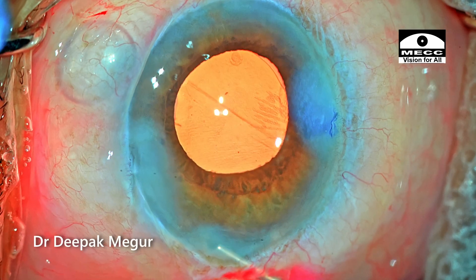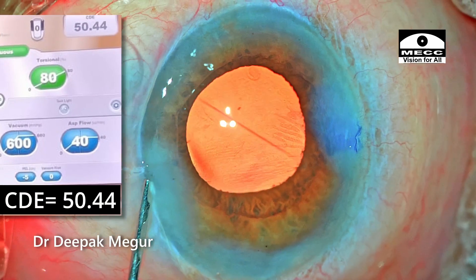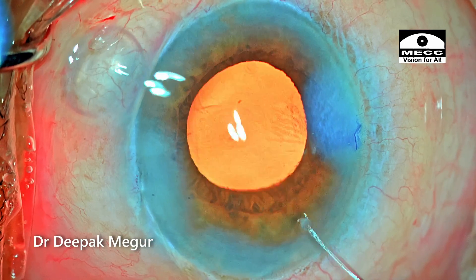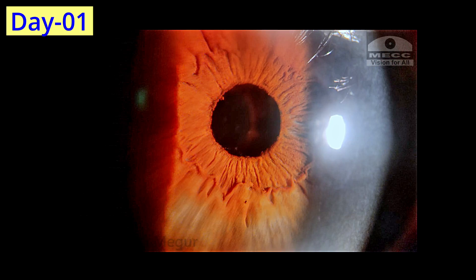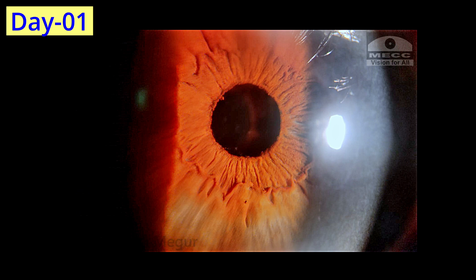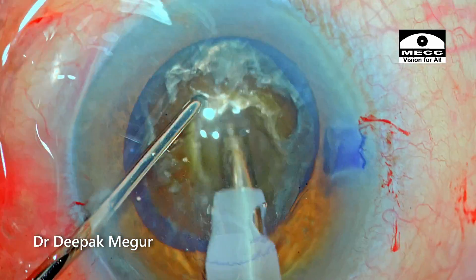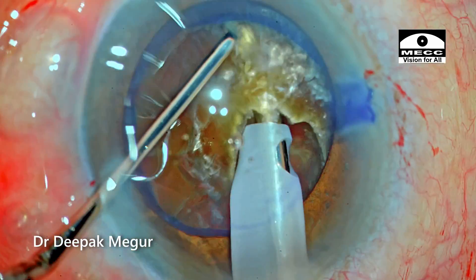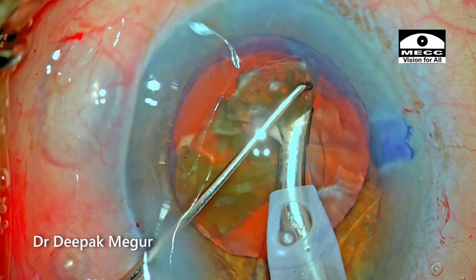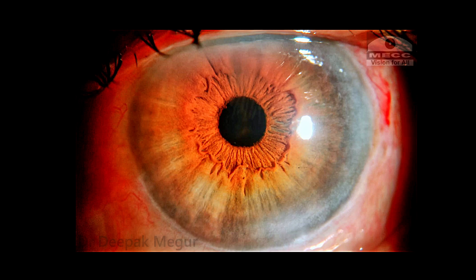At the end of the surgery, we can see the total amount of phaco energy consumed — the case is done. These are the first-day post-op pictures and the cornea is very clear; the patient is quite happy with the visual outcome. The message here is that in spite of a very dense cataract, using proper strategies we can achieve clear corneas on the first post-op day in the majority of cases if we follow certain basic fundamental principles.